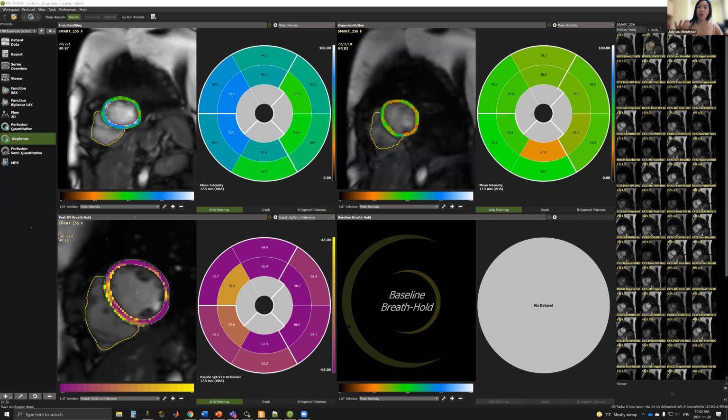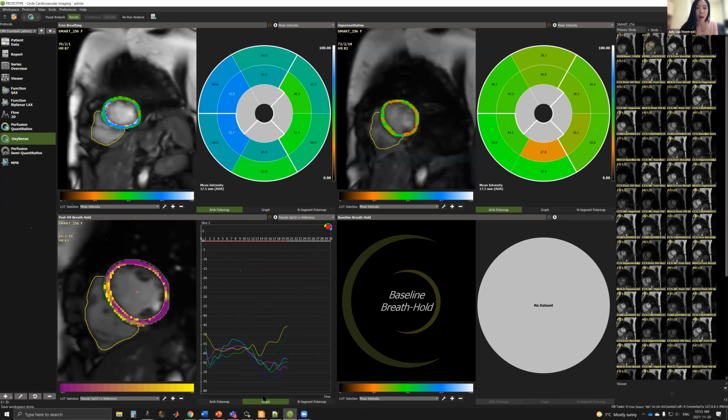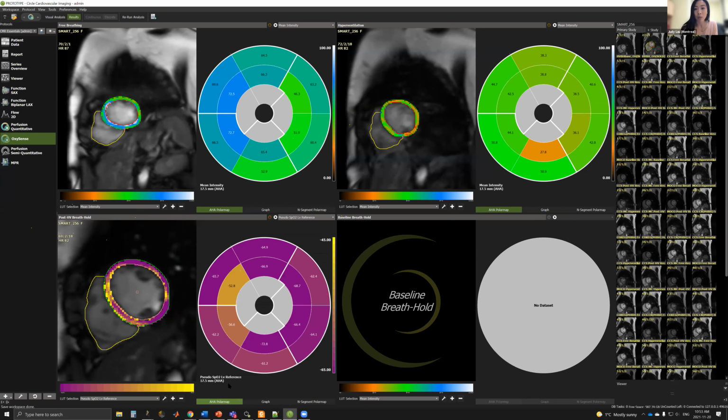I can address that question too, Mitchell. Yeah, please do. So we certainly do worry, and that's always a concern. We're not capturing the entire LV cavity, from basal down to the apex. But the area of the apical region, if there is to be ischemia, is likely a small proportion of the impact of it. Like Liz Hillier mentioned before, we want to get the highest number of pixels of highest information. And even if we were to capture that apical region, could we even trust that information?